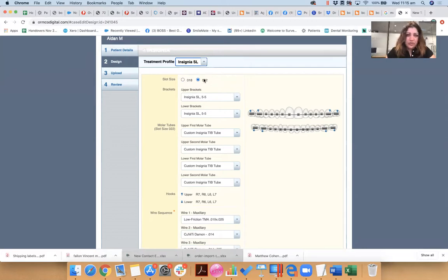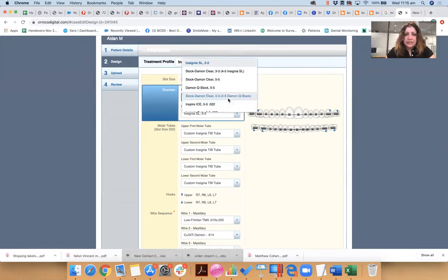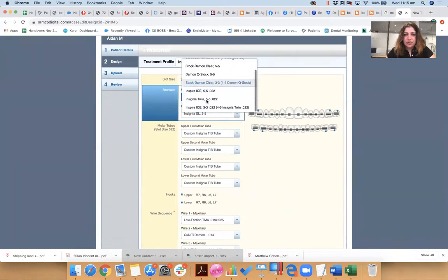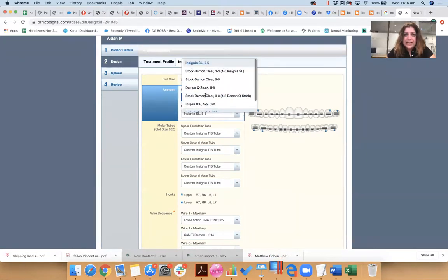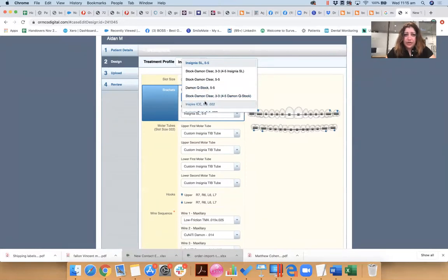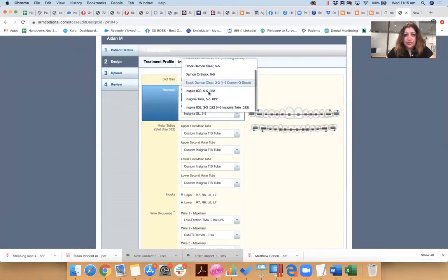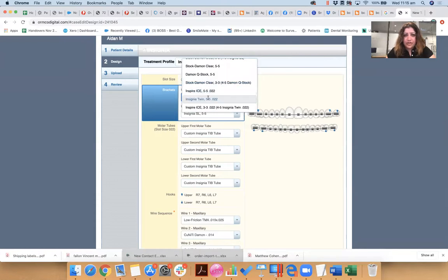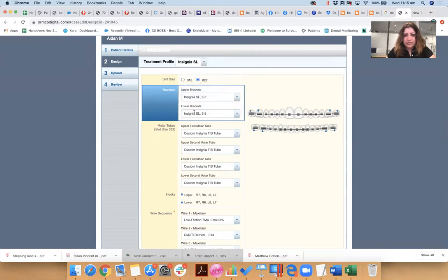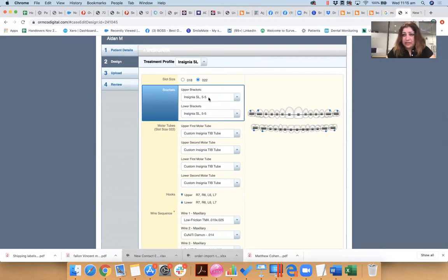I like my slot size 0.022. You can choose 0.018, but I want 0.022. I'm asking them to give me not stock standards. So see, you can buy stock standard brackets, but I like customized brackets.